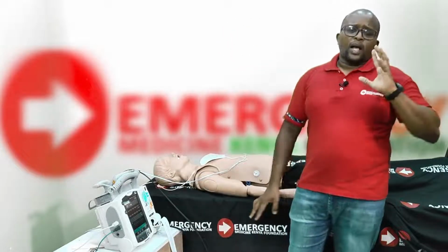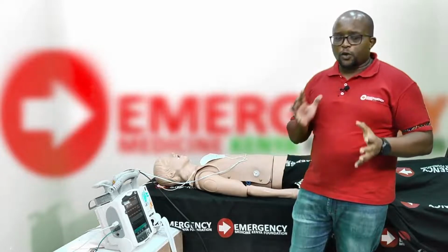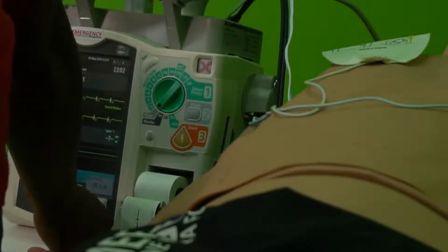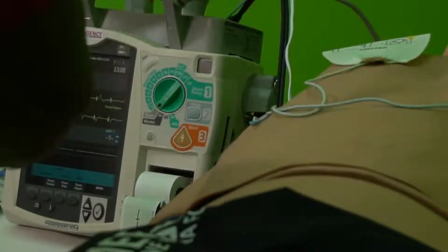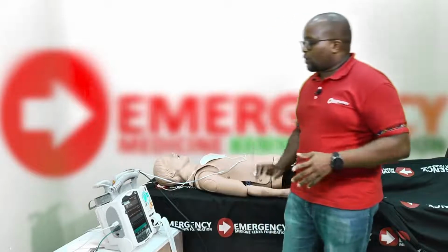All right. Just a quick troubleshooting in case things are not going as you had planned for. So I'm just going to take us back a bit to where we started from. As you can see now, we have lost capture. I've just reduced the output to remove electrical capture. Okay. So we will start again.